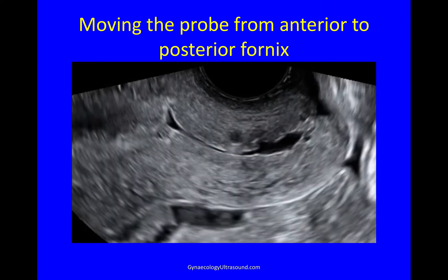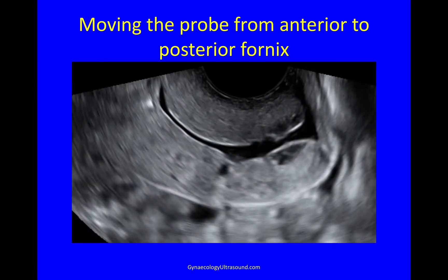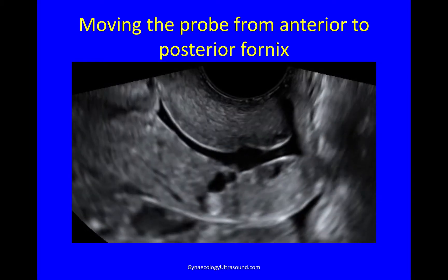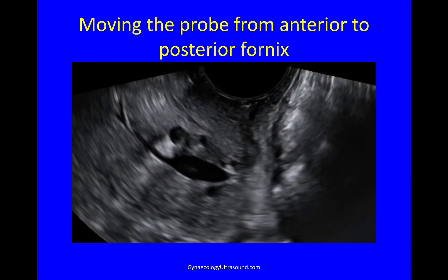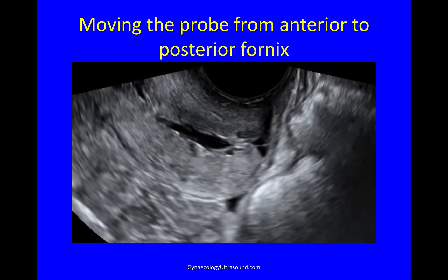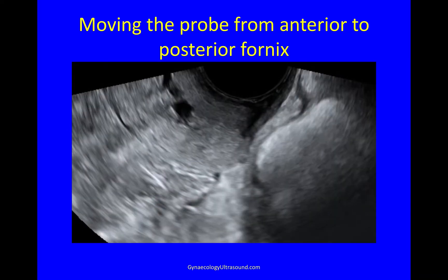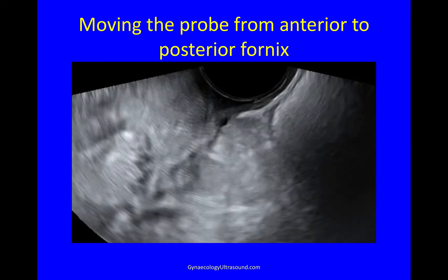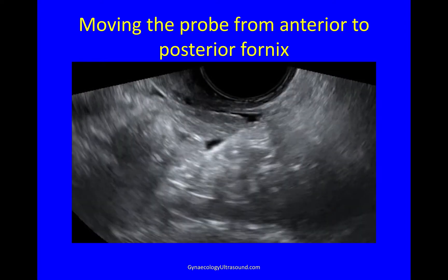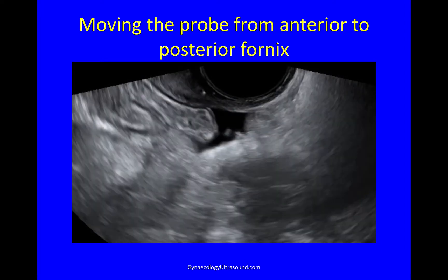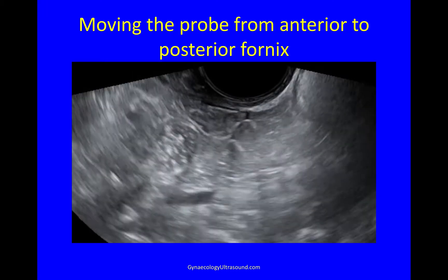There is the cervix in the longitudinal plane. I'm going to pull the probe out a little bit, then angle it more backwards toward the sacrum, and very gently nudge the cervix out of the way, stretching the posterior vaginal fornix over the tip of the probe. And now I can see the pouch of Douglas really clearly.